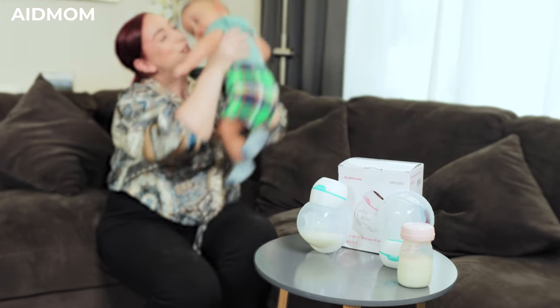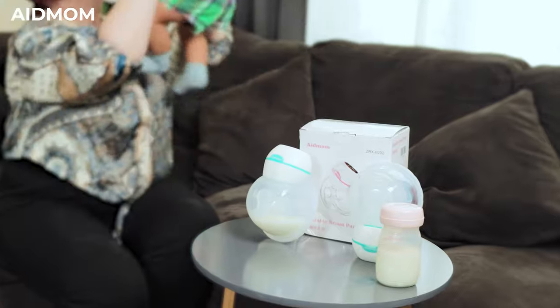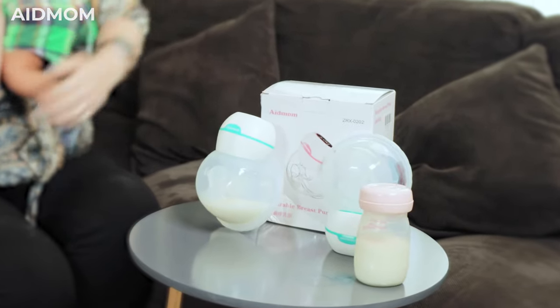Our pump is wearable and hands-free. You can pump anytime and anywhere — no tubes, no cords, no waste of time. Now you can focus on other things while you pump.